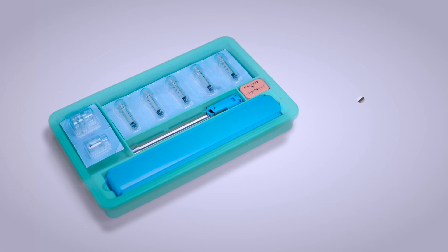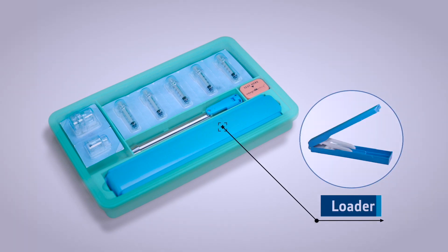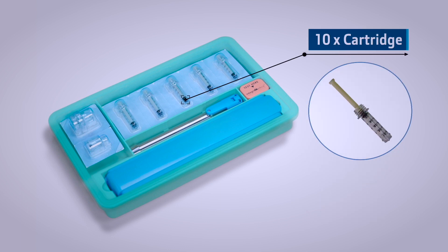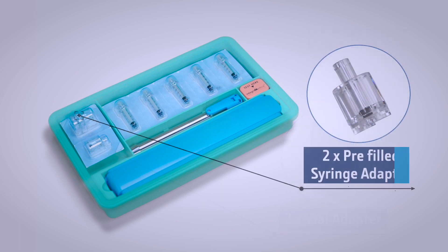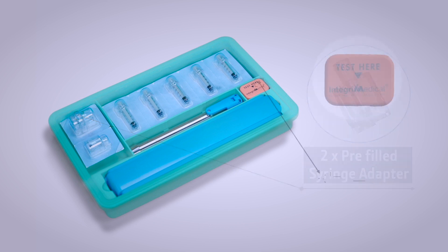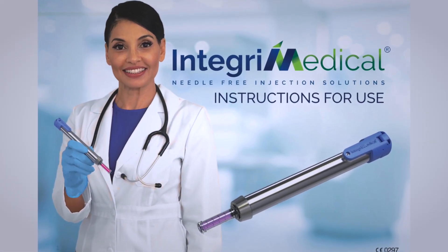It contains the NFIS device, a loader, disposable cartridges, vial adapters, pre-filled syringe adapters, a testing foam, and an instructions for use manual that has all the information included in this demo video.